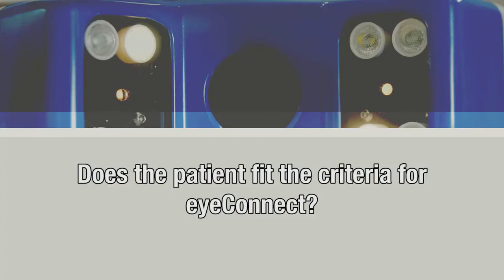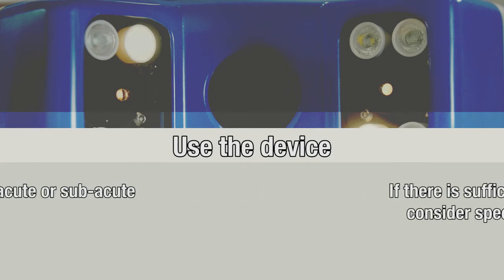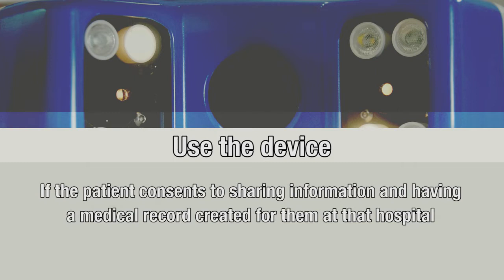Before starting the session, assess if your patient fits the criteria for eyeConnect. Is there sufficient concern to consider specialist advice? Is the condition acute or subacute? Does the patient consent to having their medical information transmitted to another hospital and to having a medical record created for them at that hospital?